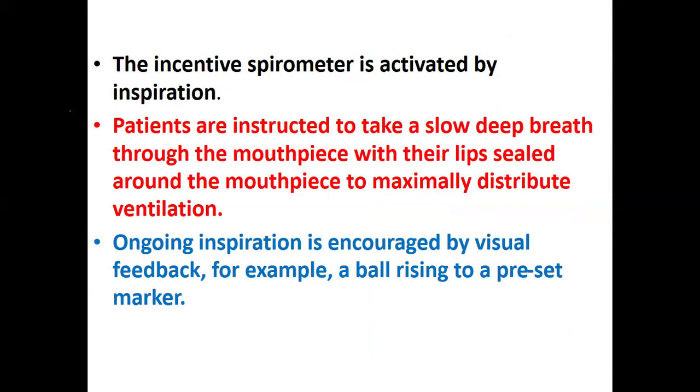The incentive spirometer is activated by inspiration. Patients are instructed to take a slow, deep breath through the mouthpiece with their lips sealed around the mouthpiece to maximally distribute air. Ongoing inspiration is encouraged by visual feedback, for example, by seeing the ball or the goal marker.